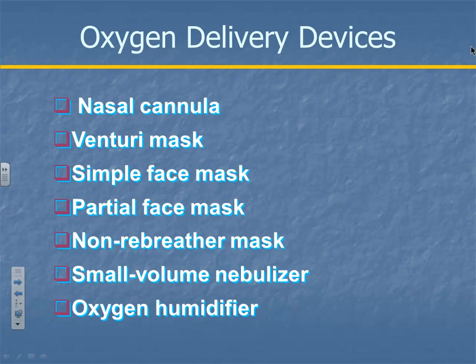Oxygen delivery devices. Now y'all are going, oh, we know those. Some of these things you're going to see, like a Venturi mask. There are going to be questions about the Venturi mask on National Registry. We don't use the Venturi mask in the field, but how is the Venturi mask different than, say, the non-rebreather? You can dial this. You can change the concentration of oxygen. It's a variable. So patients that have long-term respiratory disease, they're in the hospital, they may dial it down as the patient gets better. So Venturi mask, it's variable concentration. You can dial that up and back.